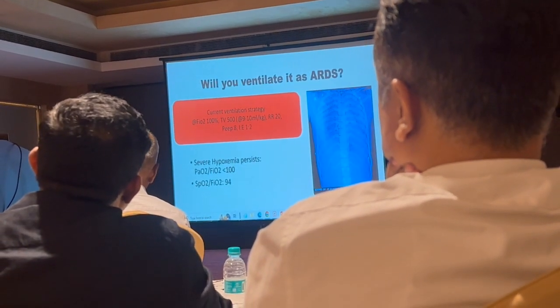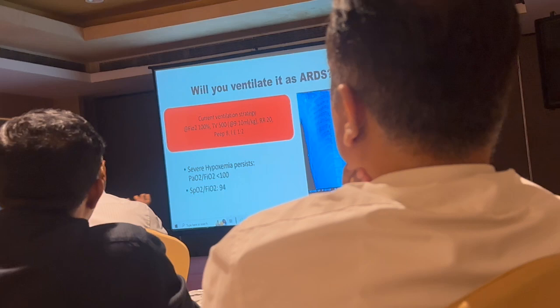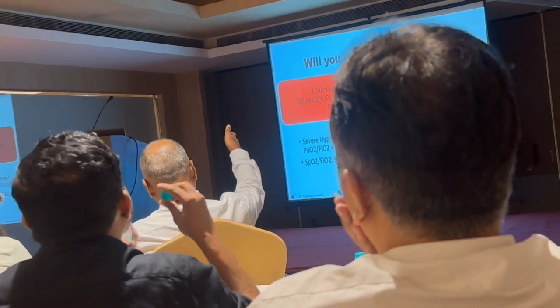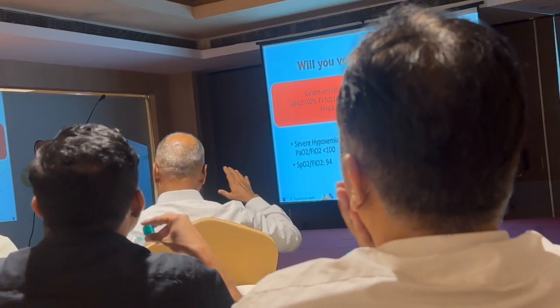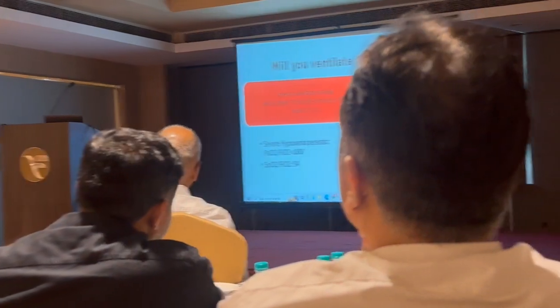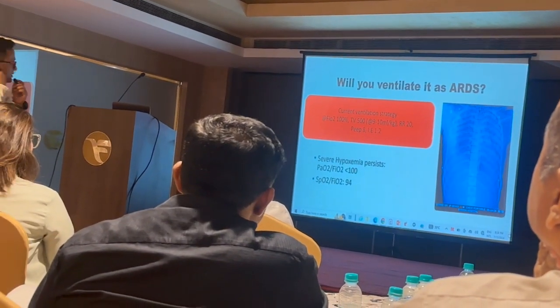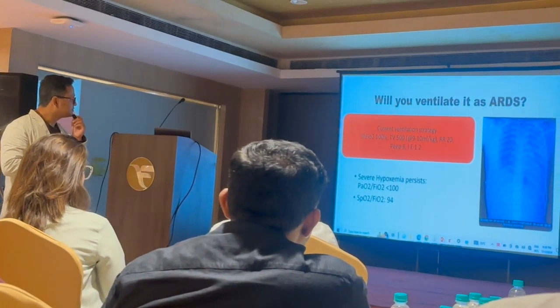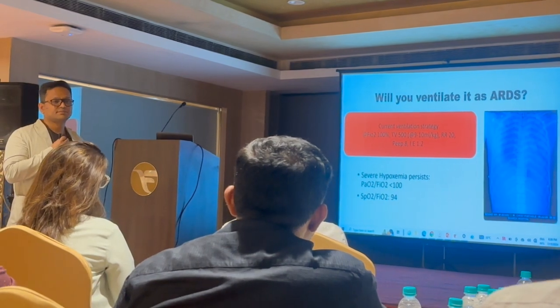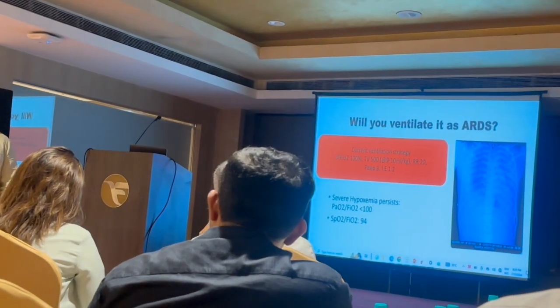So Dr. Sharma, on the basis of this, your proposition is that we are dealing with ARDS, right? Yeah. Maybe severe CAP may go to ARDS very soon, depending on what kind of settings we give this patient. A tidal volume of 500 ml is fairly high for this patient, I will say. Ideally, I would give about 6 ml, or 6 to 8 ml maximum per kg, ideally 6 ml per kg body weight tidal volume to the patient. A rate maybe on the higher side, 25 to 30, to maintain minute ventilation and come down from hypercapnia, and to keep the peak pressure limit up to 30 and plateau pressure 20 to 25. Try to keep the pressures lower to limit ventilator-induced lung injury. That should be our aim.